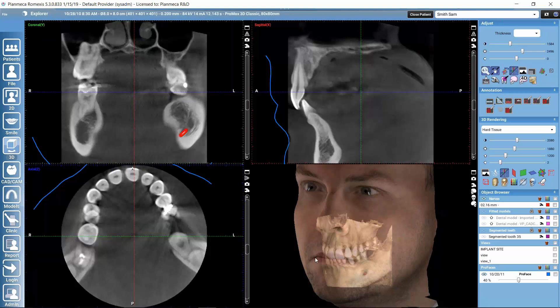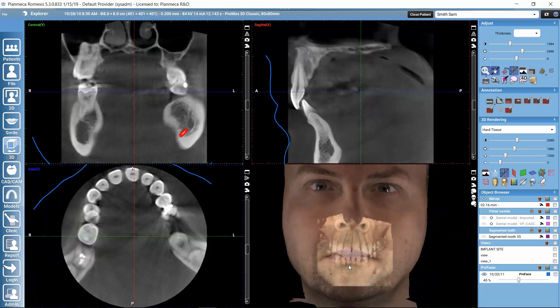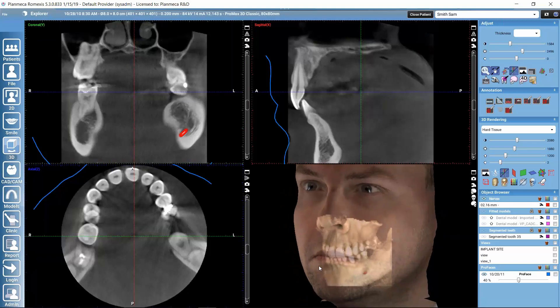If we don't need the 3D rendered view on a workstation, there is an option in the admin module that lets us hide this 3D rendered view on that workstation, saving the computer's processing power.